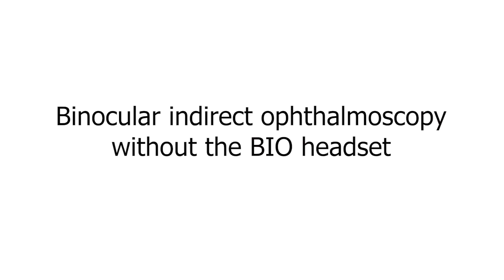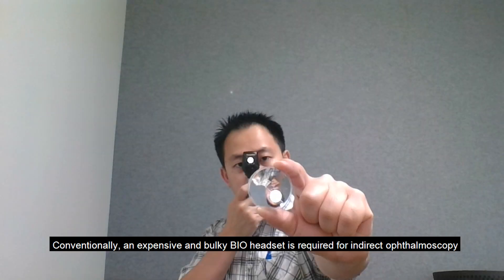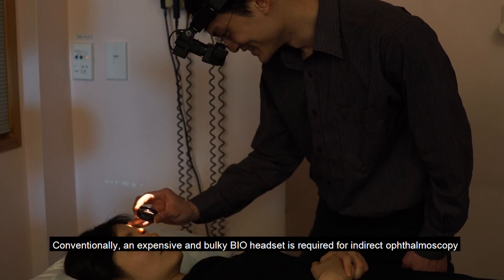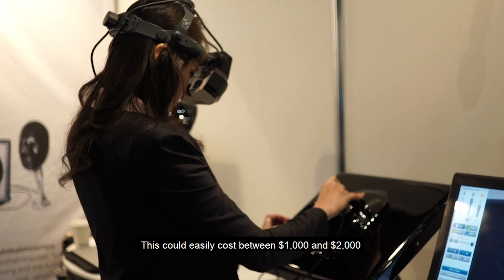A cheap and simple binocular indirect ophthalmoscopy technique without the BIO headset. Conventionally, an expensive and bulky BIO headset is required for indirect ophthalmoscopy. This could easily cost between $1,000 and $2,000.